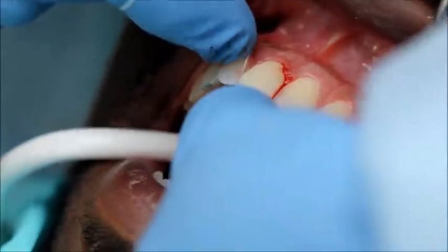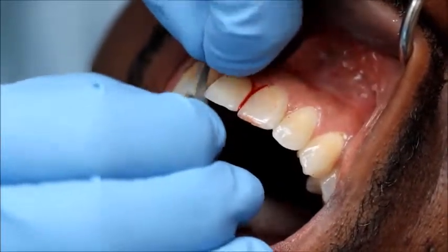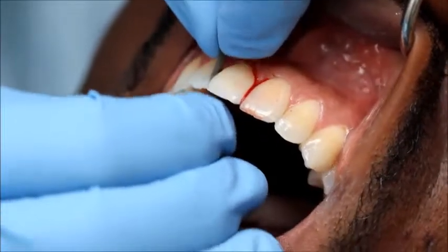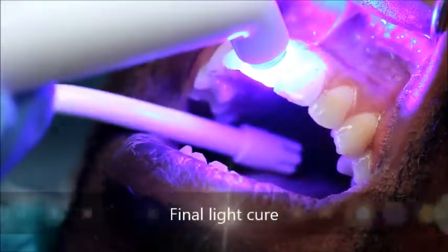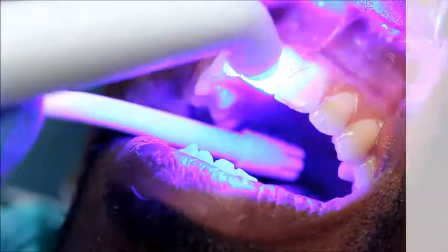If floss cannot be passed, either a polishing strip or floss threader can be used to break contact. In order to prevent this problem, Teflon tape can be placed on the adjacent teeth while bonding the crown. A final cure of the cement is then performed for 60 seconds on the facial and lingual surfaces of the crown.